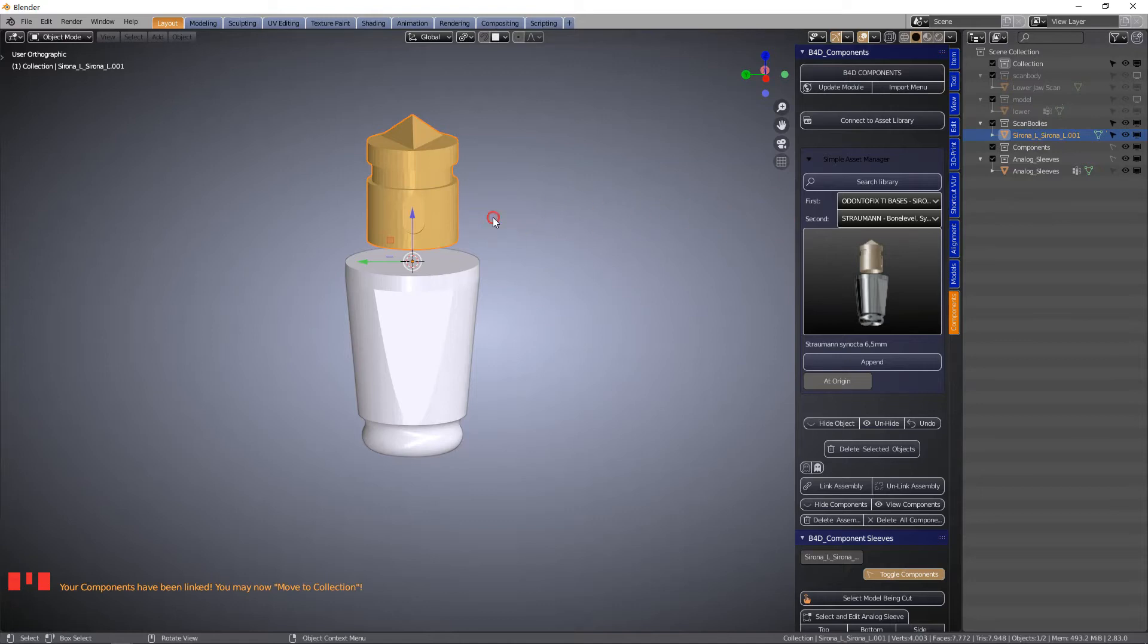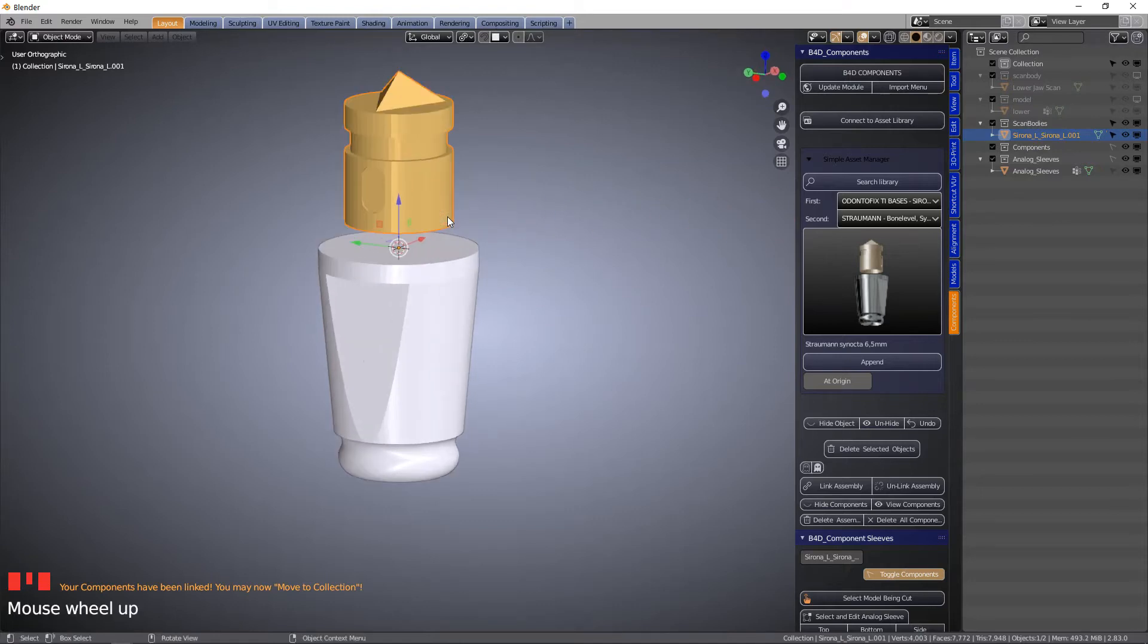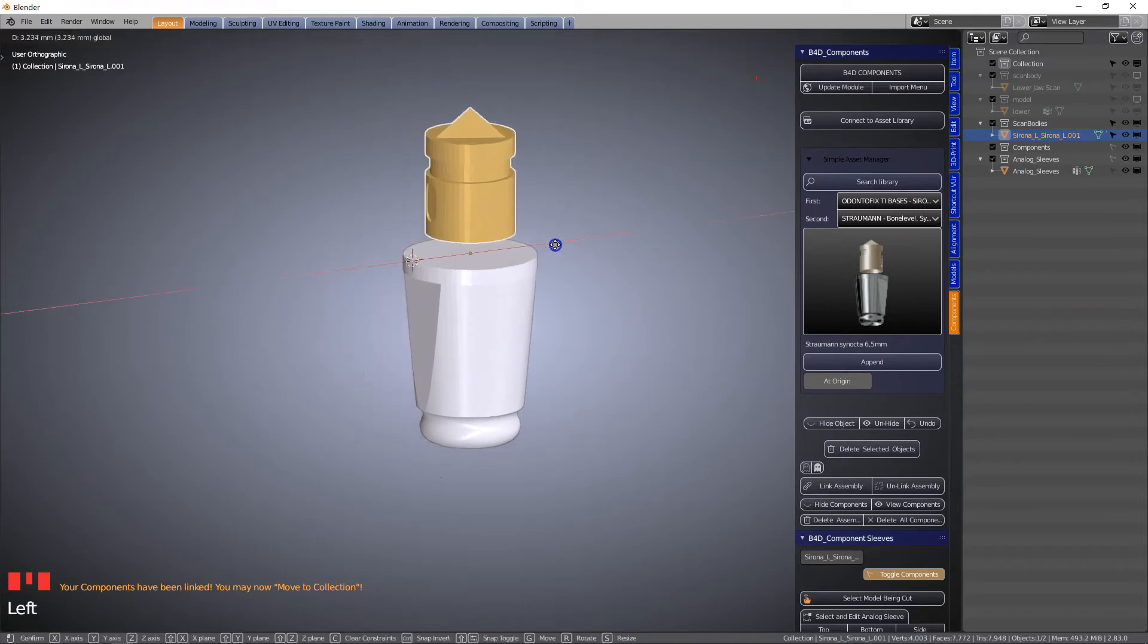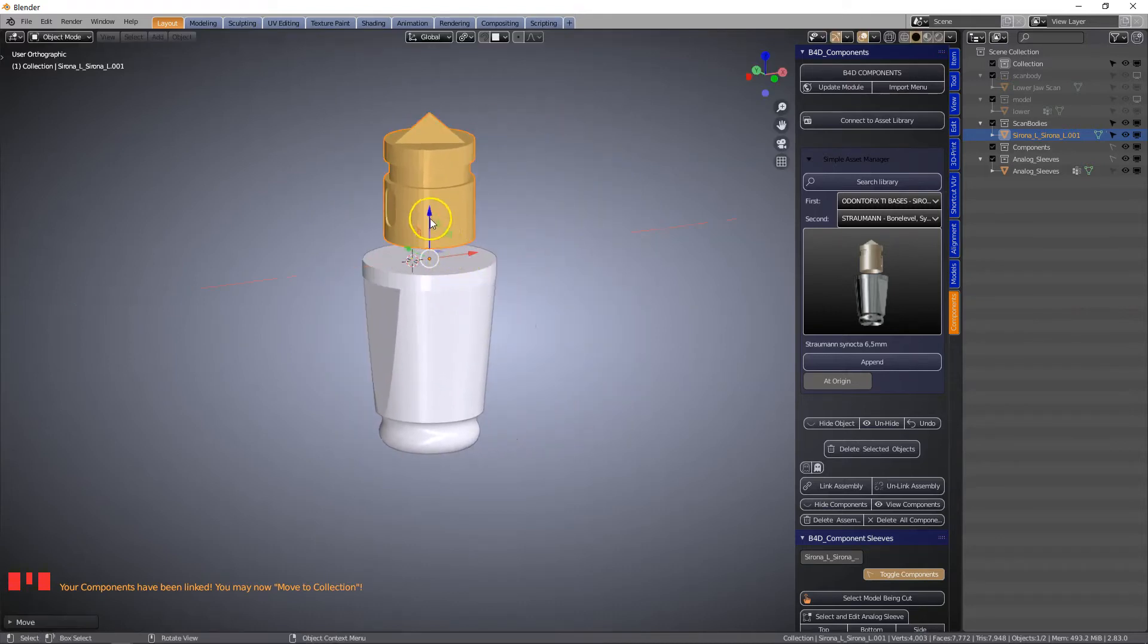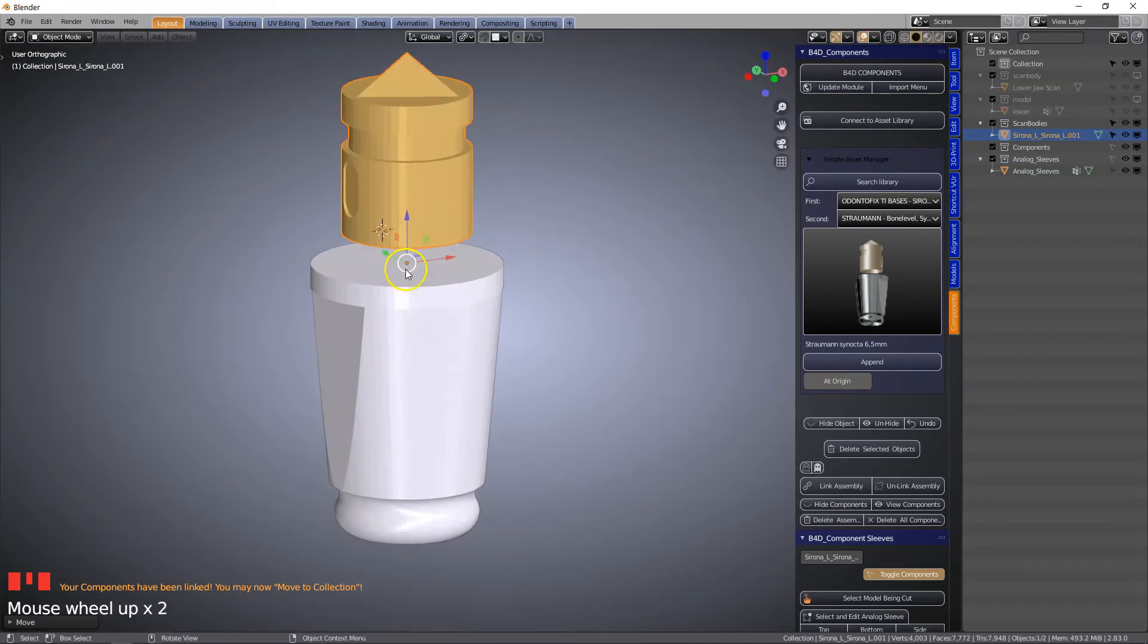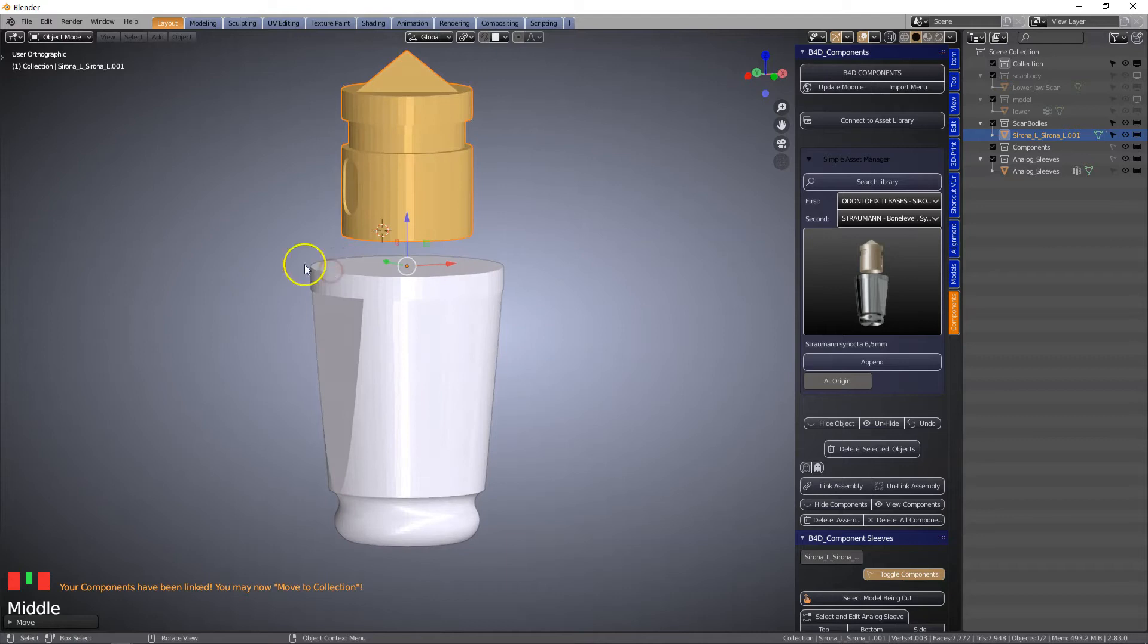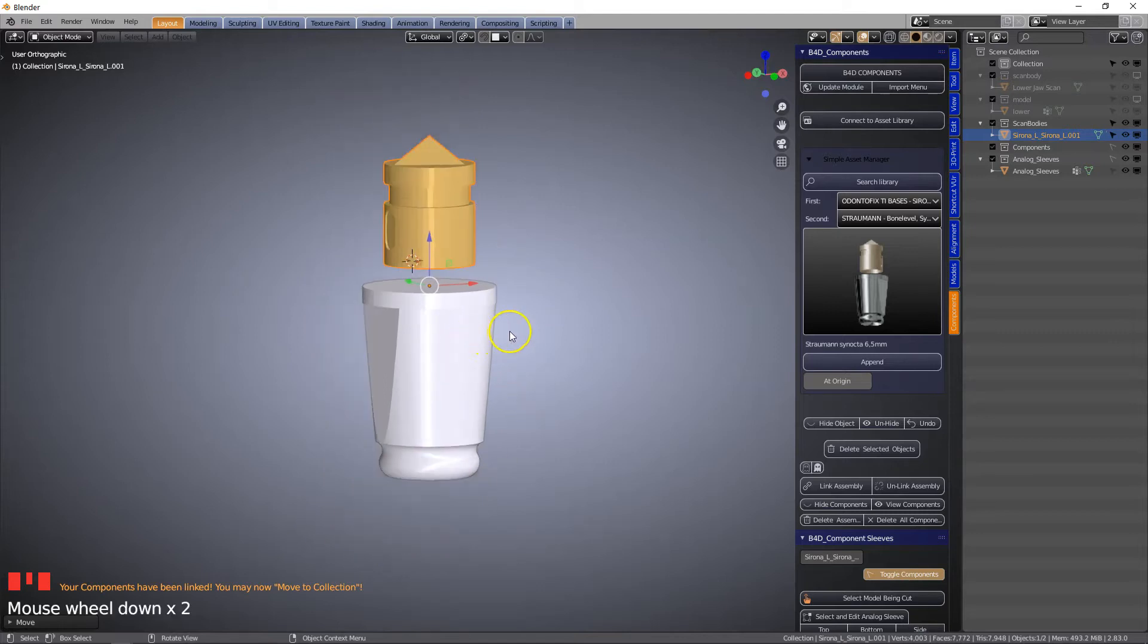The scan body will turn orange. This means that the scan body has been linked and we can now move it wherever we like. The reason why we don't move it is because the script will recognize the top of the analog, the bottom, and the sides of the analog.